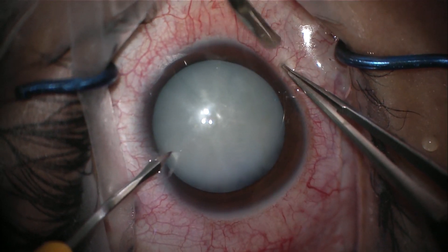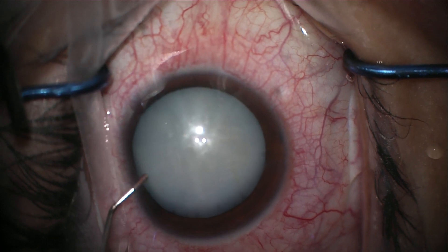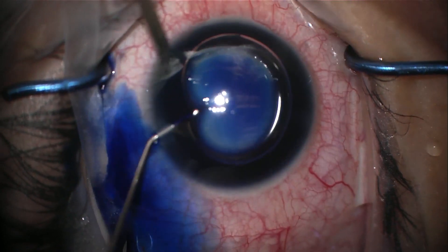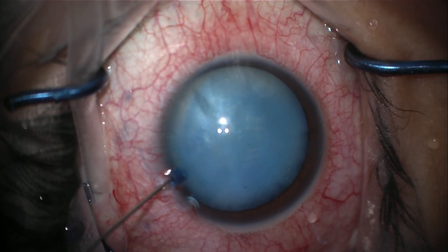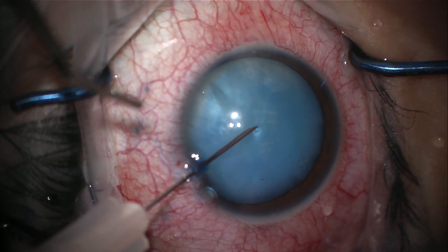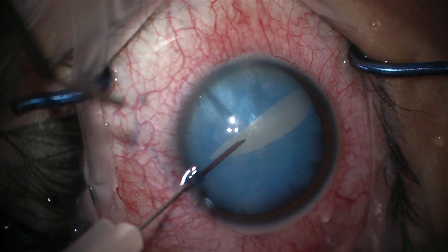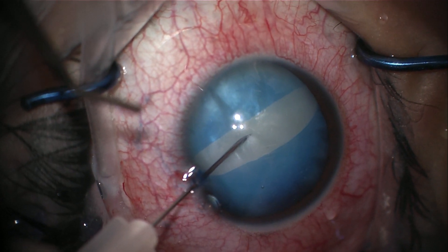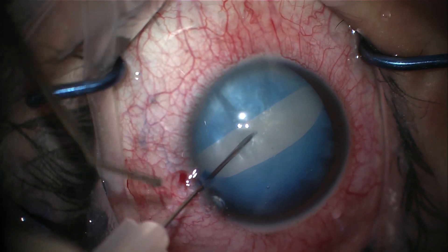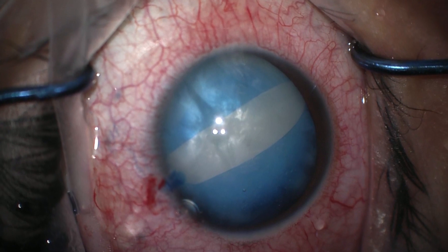Two paracenteses are made to allow access into the anterior chamber. An air bubble is placed in the anterior chamber and tri-pan blue stain is added to stain the anterior capsule. Knowing there was a high likelihood of increased posterior pressure due to the presence of silicone oil in the eye, a 27-gauge needle is introduced to penetrate the capsule and aspirate liquefied cortex. The differences in pressure cause the lens to push forward, leading to a biradial capsular tear — a great example of the Argentinian flag sign.